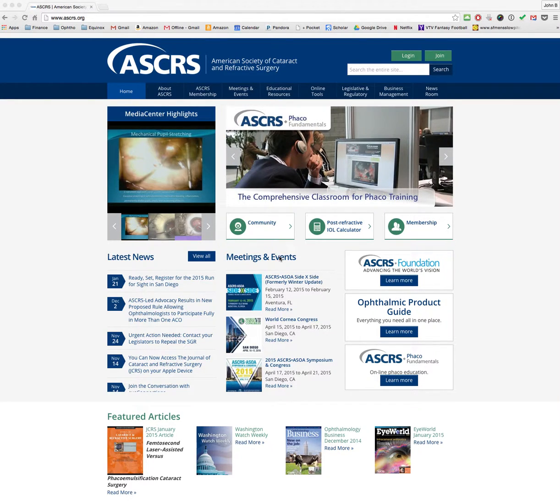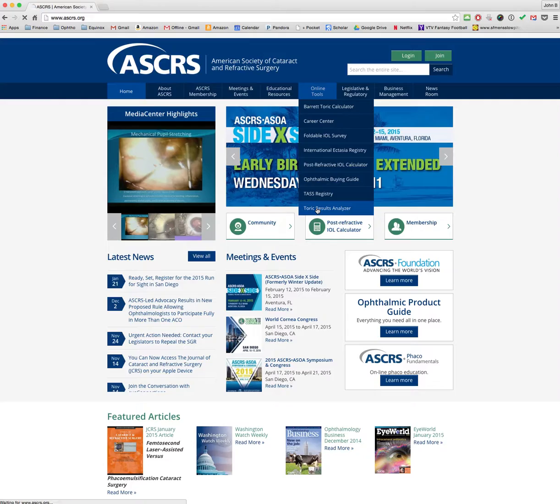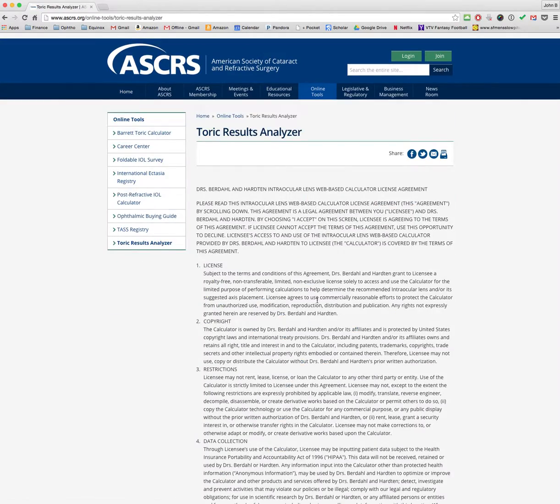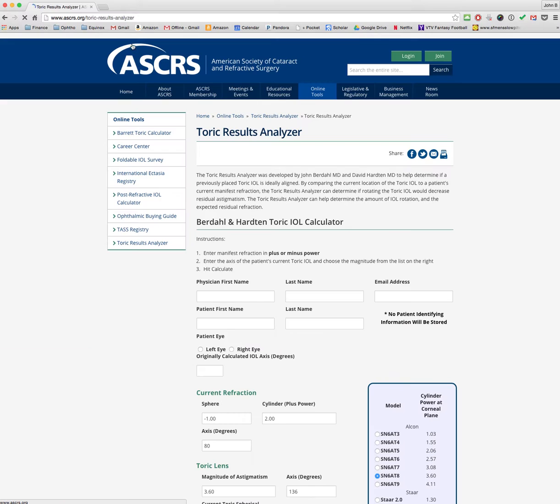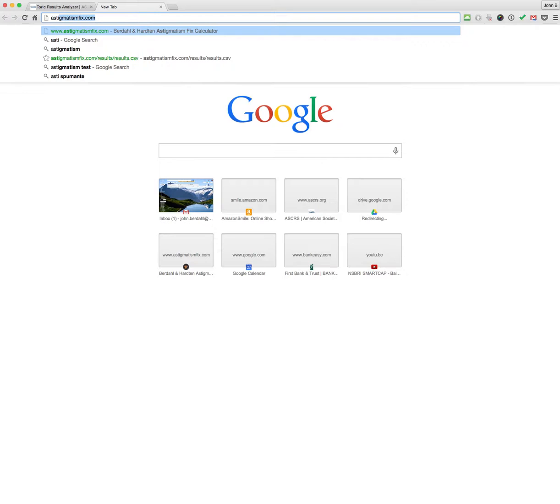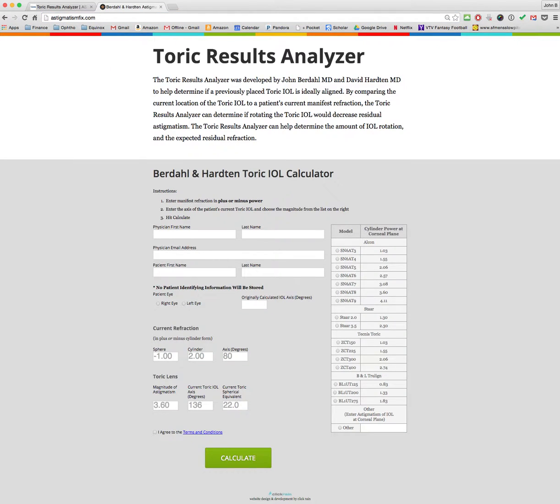There are two ways to get to the website. The first is through the ASCRS website — go to Online Tools and click down to the Toric Results Analyzer. That will bring you to the page after you accept the terms and conditions. An easier way is to just type in astigmatismfix.com.